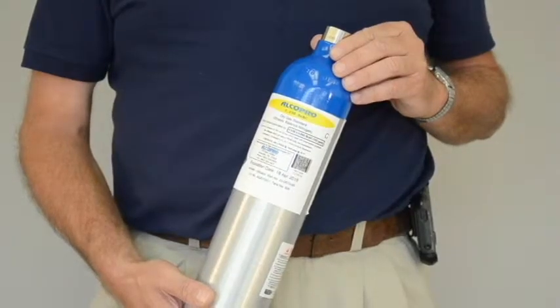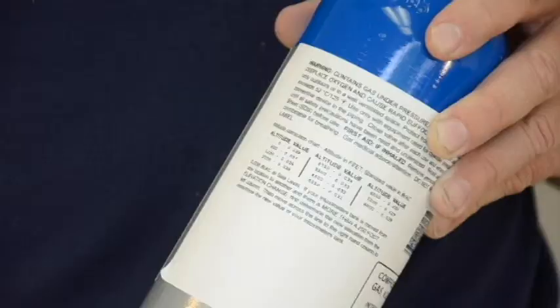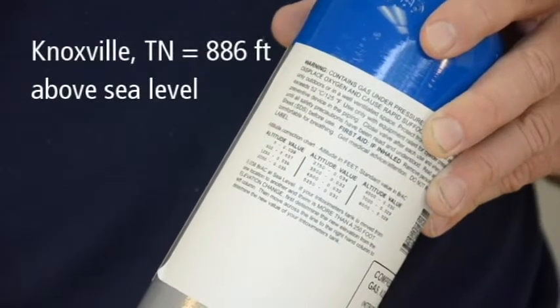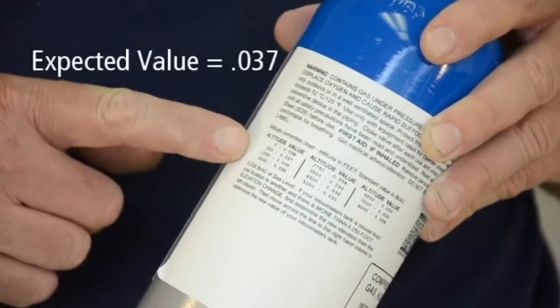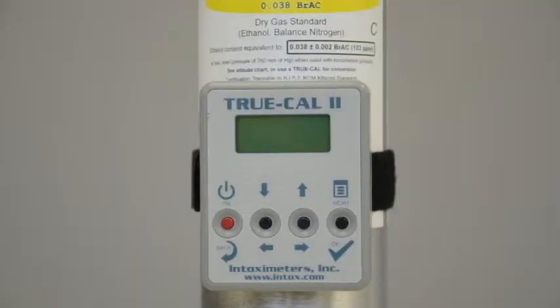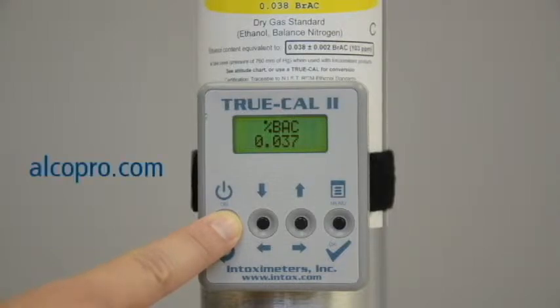The expected or target value of your gas standard can be derived by referencing the altitude chart on the back of your tank. For example, if you are performing an accuracy check in Knoxville, Tennessee, which has an altitude of 886 feet above sea level, the altitude chart shows the expected value of the alcohol gas tank to be .037. You can also derive the expected value by using a TRUE-CAL device, which uses atmospheric pressure to predict the expected value of the gas. You can purchase a TRUE-CAL device at alcopro.com.